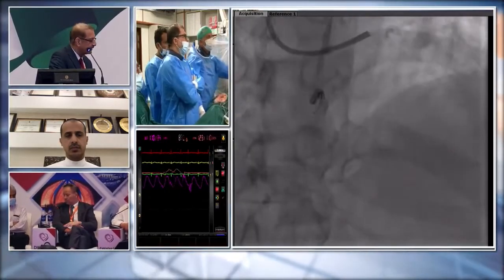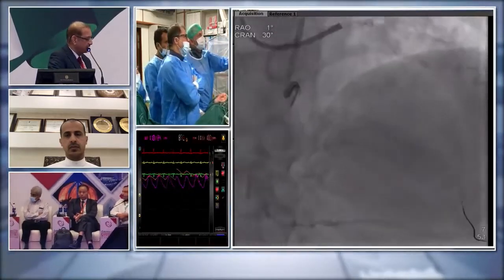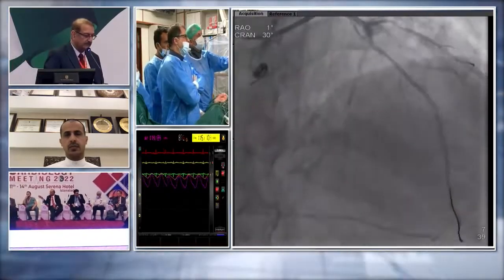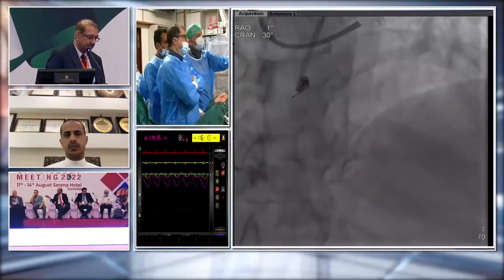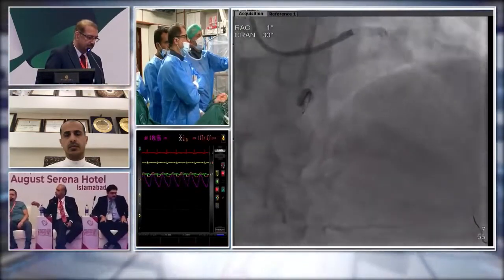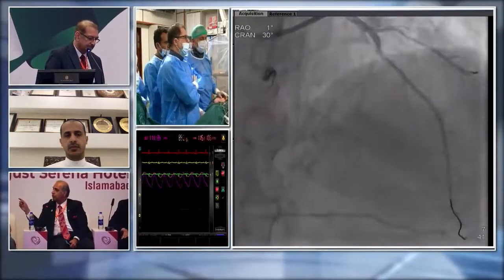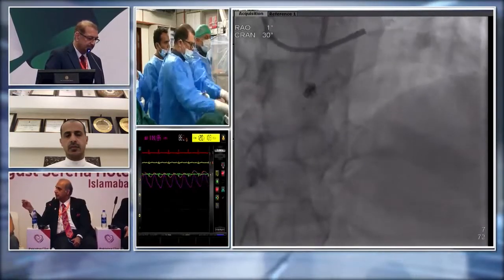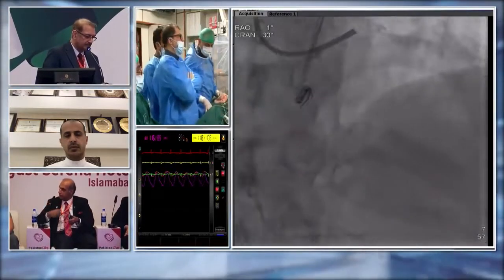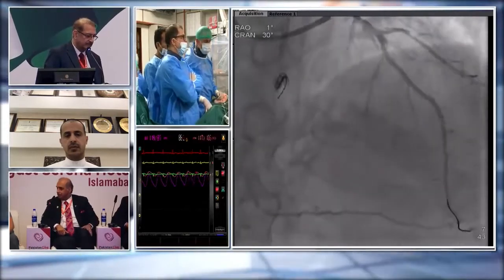Would you consider changing the catheter of the left main? Would you consider changing the catheter? No. What I mean is that if the disease is there in the left main, as it is visible, and you still want to do this one, would you opt to change the patient towards coronary artery bypass grafting, or would you say that we go with a 4 French in the left system for a retrograde injection and try to do an antegrade? You'll fix the left main first. Yeah, that's the easiest one.